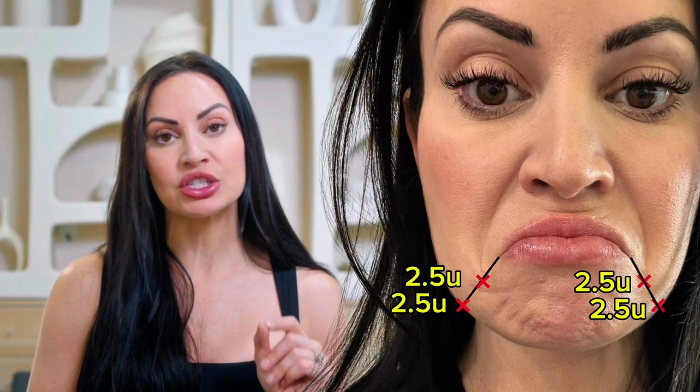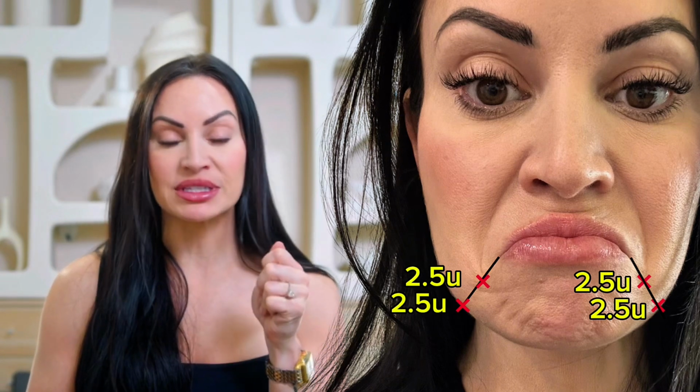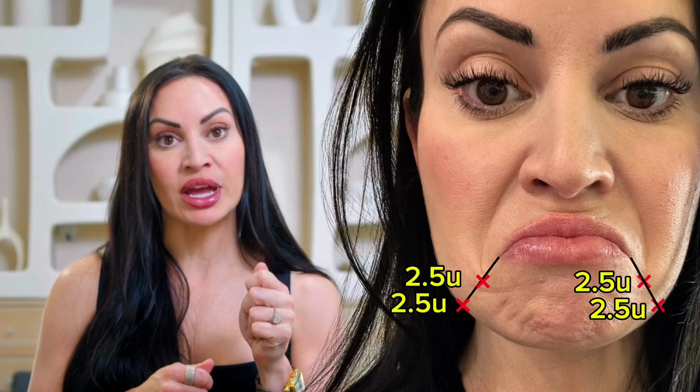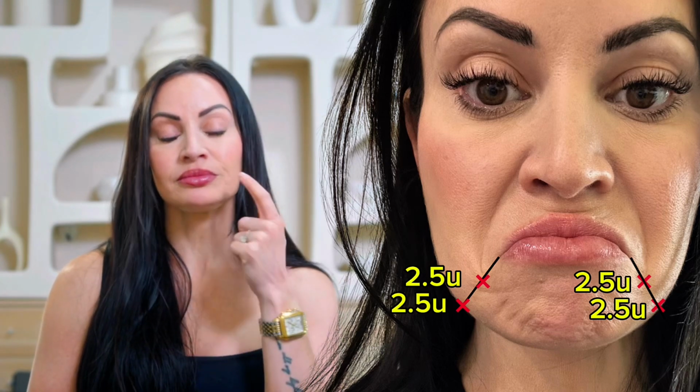Now, how do I avoid hitting the DLI? Well, first, let me tell you my units. I typically do 5 units per DAO. So I draw up a 10 unit syringe and I'll do 2.5 per injection poke. And the way I do it is I have them frown.